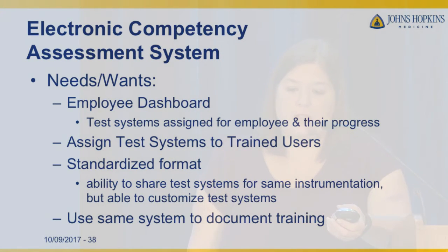And then you'd also have the standardized formats. And if you also possibly have some involvement with the people that make your instrumentation, sometimes they already have competency assessment methods that you could literally import and use as your own, so you don't have to reinvent the wheel. Ideally, they should know your instrumentation better than you do. So you just want to keep those things in mind, and this is what I would like to see in the future. Just so you know, I haven't come across one that meets my needs or my wants yet, so hint, hint, hint, hint.